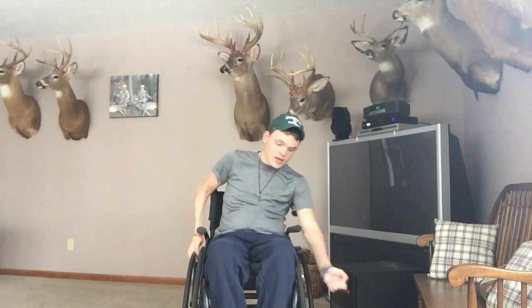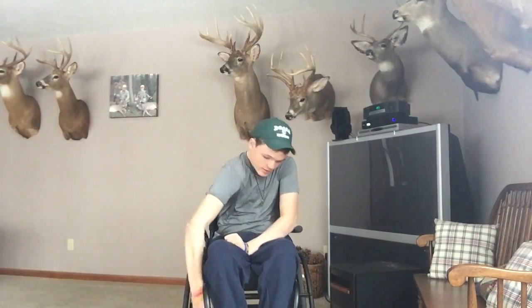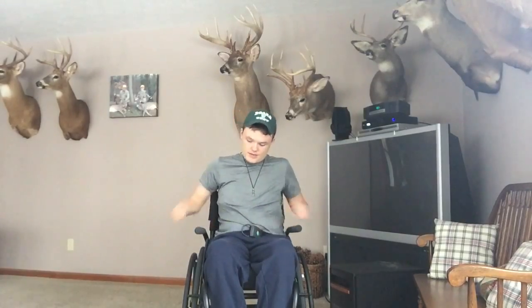For every 15 to 30 minutes of being in a wheelchair, you should do these pressure releases for 30 to 90 seconds. There are four main ways to do pressure reliefs in a manual chair, and the first way is to lock your brakes, loosen your seatbelt if you have one on, and then if you have enough strength, grab onto your push rims or tires and push down and try and lift yourself up. You want to be cautious of spasms, because normally they can happen, or at least they do for me.